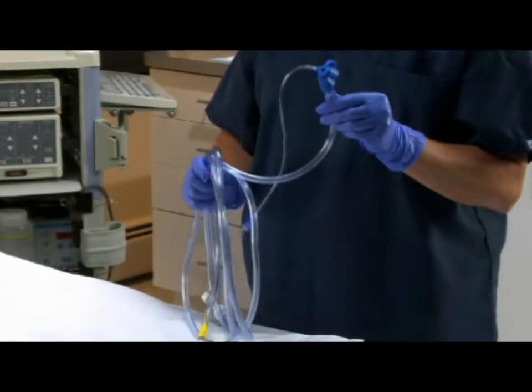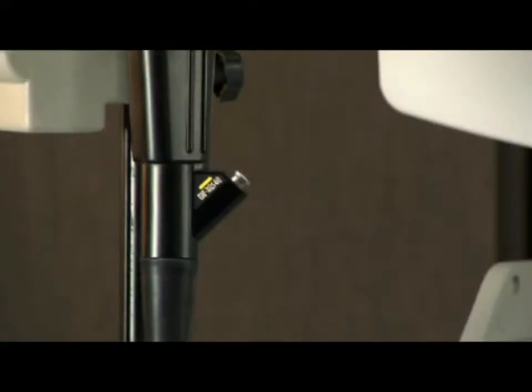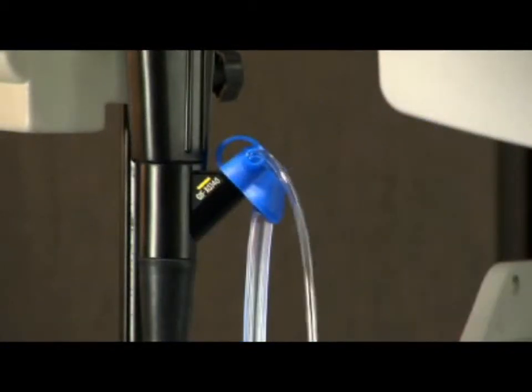To connect the BioVac device using the endoscope suction source, remove the existing biopsy valve and attach the BioVac device's biopsy valve to the biopsy inlet.